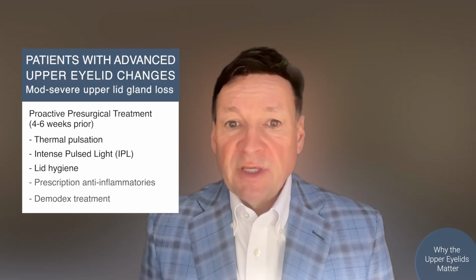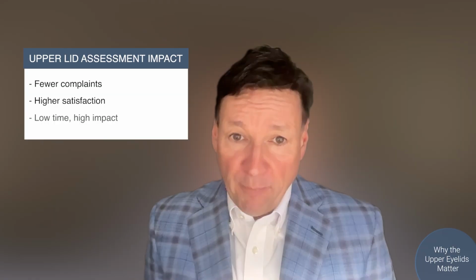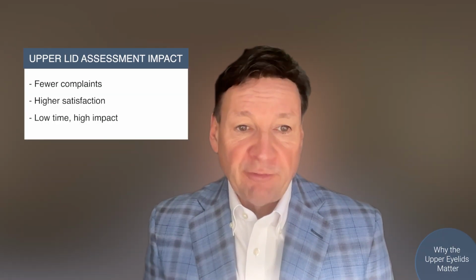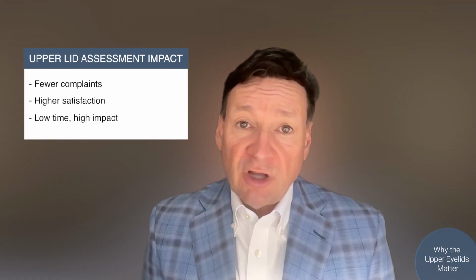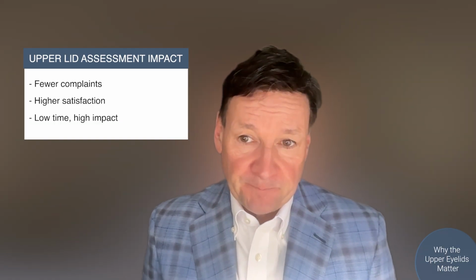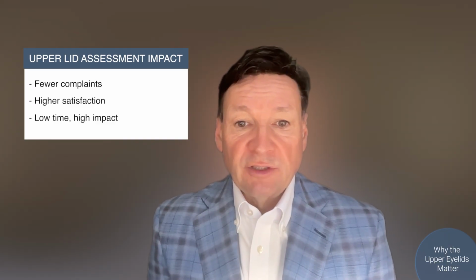The results have been a noticeable reduction in early postoperative dry eye complaints and higher satisfaction scores. I would encourage you to consider bilateral upper and lower lid meibography as part of your standard pre-op cataract workup. The incremental time is modest, on the order of 20 to 30 seconds per patient, but the impact on postoperative comfort and quality of vision can be substantial.